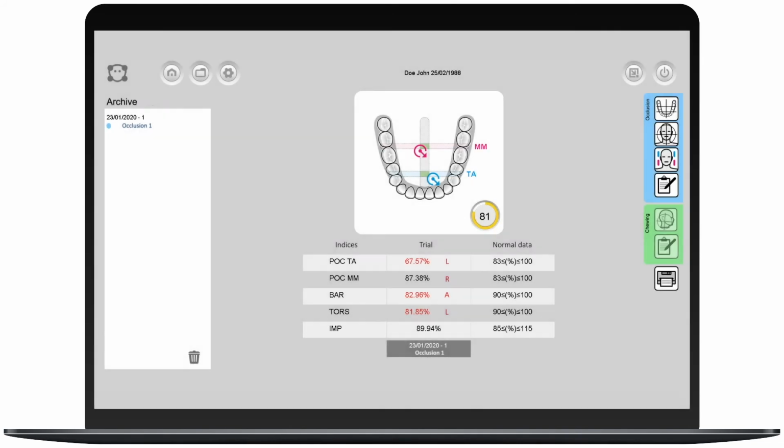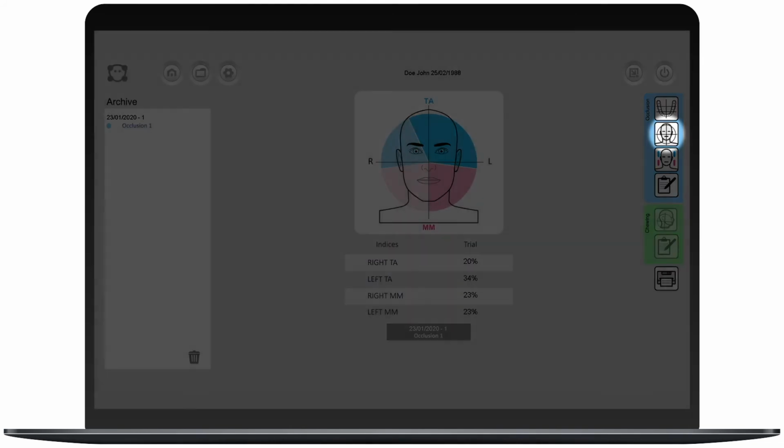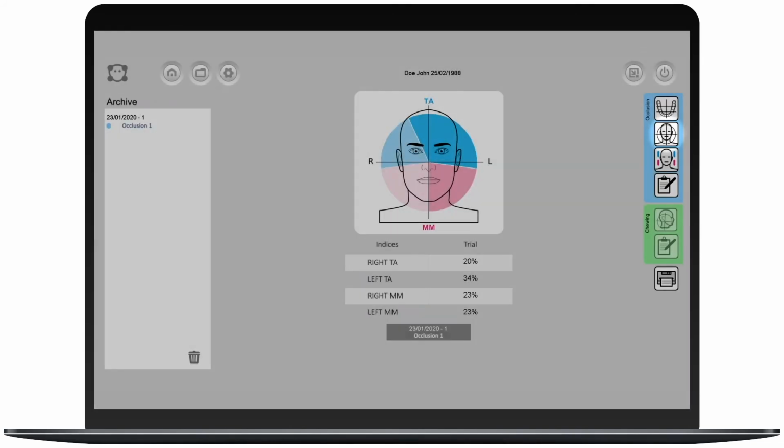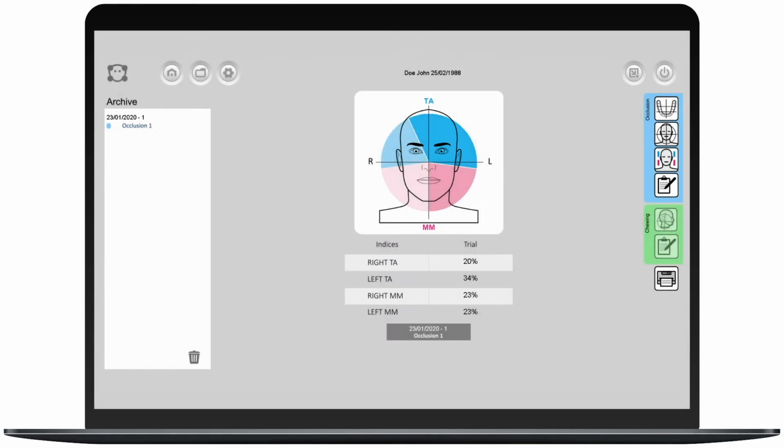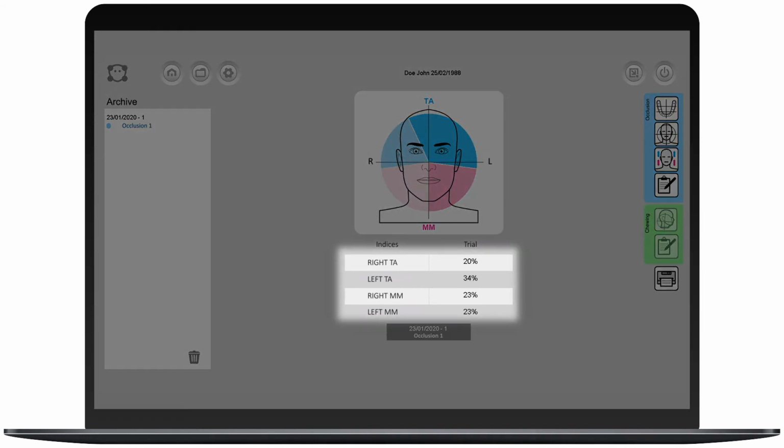By clicking on the second button on the occlusion sidebar, you can analyze the muscles through a pie chart. This pie chart allows us to assess the muscle activity distributed in the 4 quadrants of the face. In this specific case, there is a prevalence on the left temporalis compared to the right. It is also possible to check the percentages in the table below.